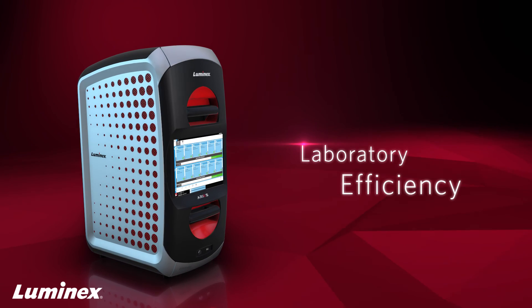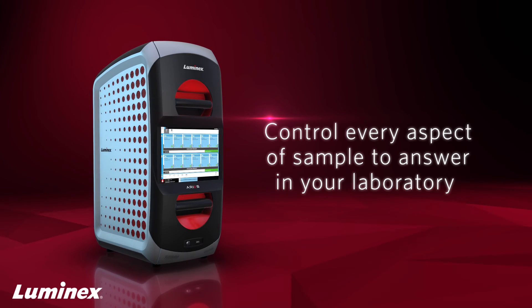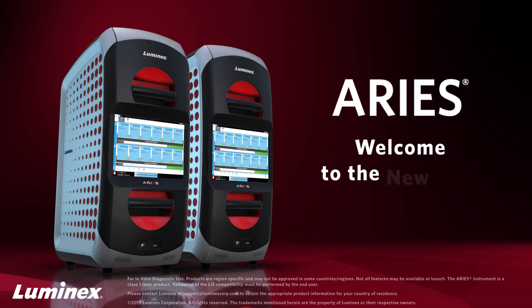With maximized laboratory efficiency, streamlined workflow, and result accuracy, ARIES allows you to control every aspect of sample-to-answer in your laboratory. ARIES. Welcome to the new way to work.